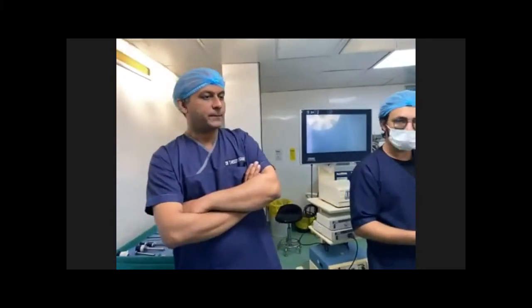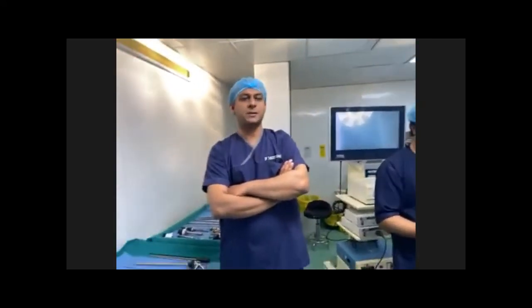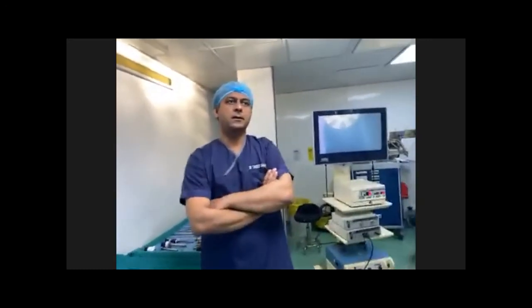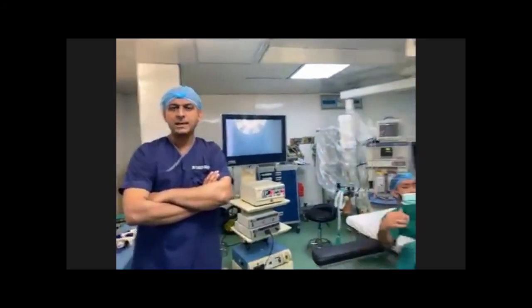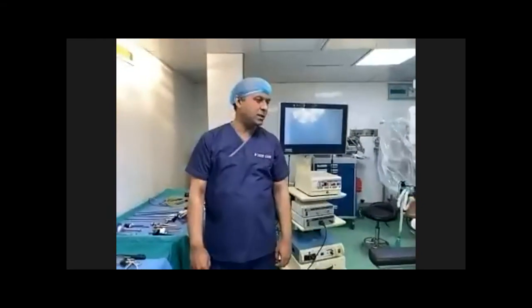So now we will be going towards patient positioning in laparoscopic surgery. The positioning usually has all the same terminologies as in open surgery. The most commonly used position in laparoscopy is the supine position. The most important thing when you are considering the supine position is where to put the arms. There are two ways of putting the arms.